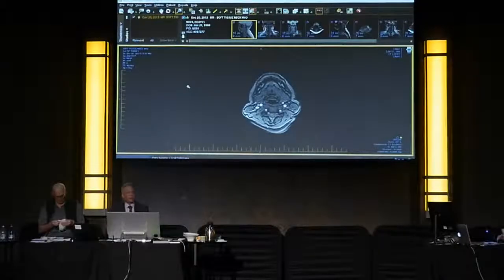When you're looking at a vascular case, you might say, well, how do I know it's a vascular case? Patient comes in with acute neurologic deficit. It's a vascular case. Patient has sickle cell disease, and they have weakness of the right hand. It's a vascular case. Use your medical skills to apply to radiology.